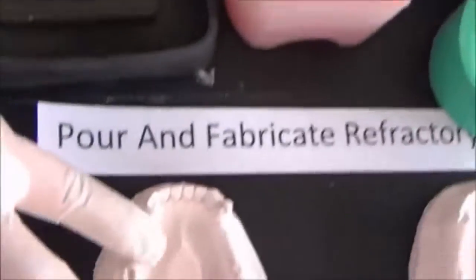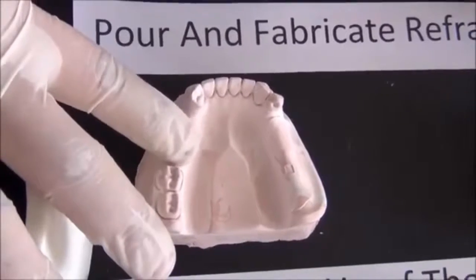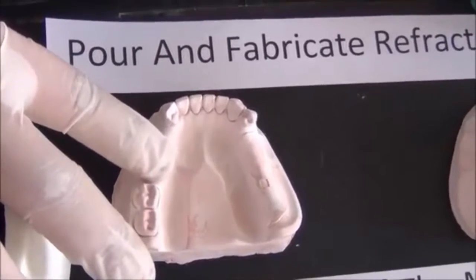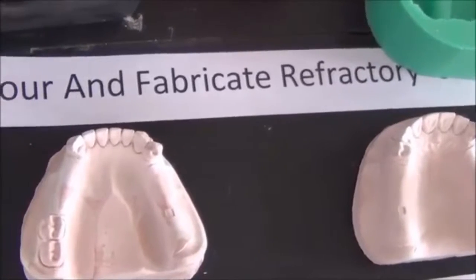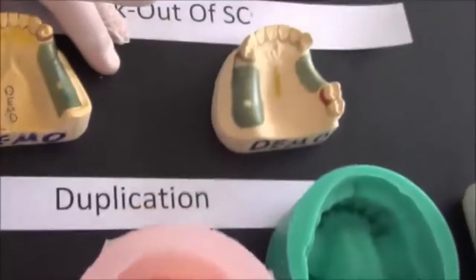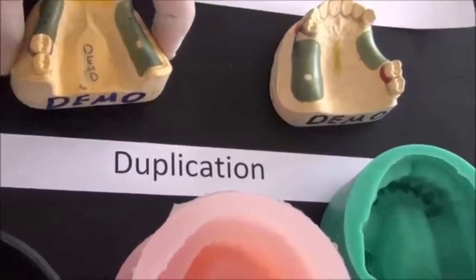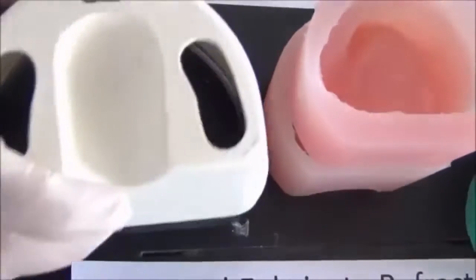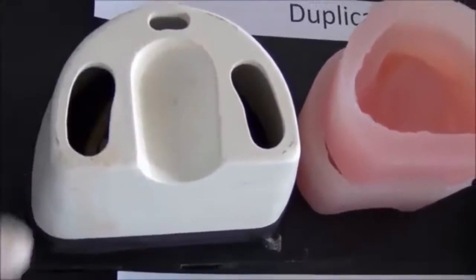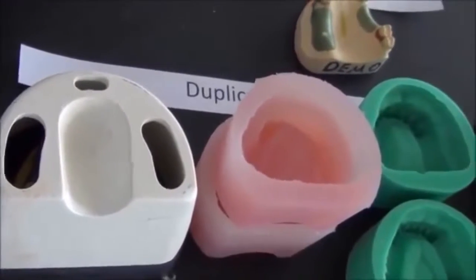We need to use another material that could stand the temperature of this process, and it's called refractory material. So how do I change this to this? I need a process called duplication. By duplication, what do I do? I simply take out the cast, put it inside this flask, and close it, and then pour over it a duplication material.